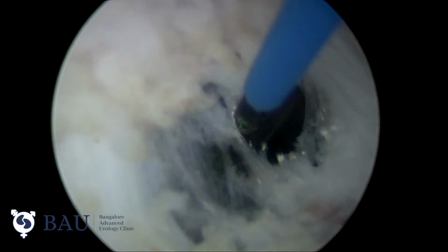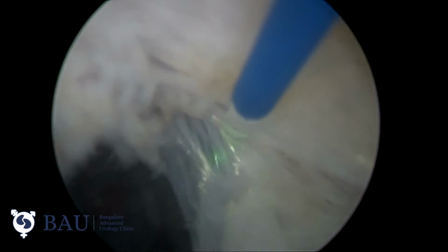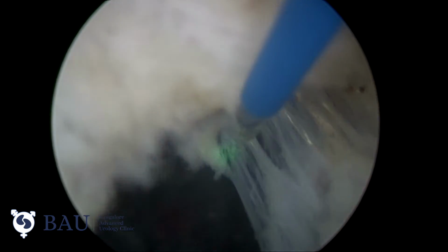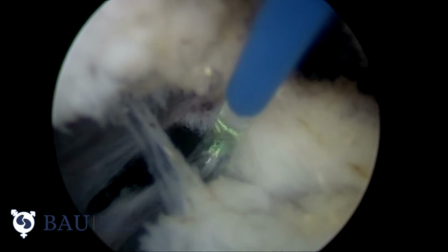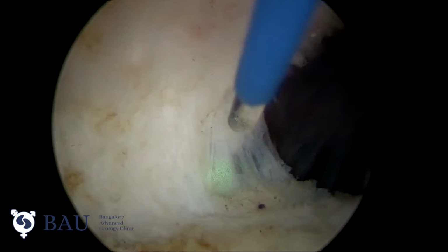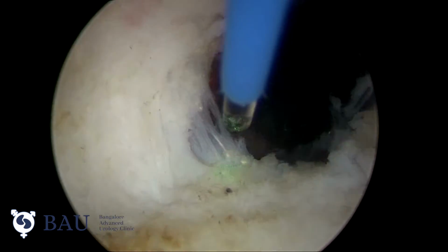So this is the bladder neck fibers. We have to make sure that there is no major bleeding from the mucosa here. That will disturb our morcellation. Once we identify the bladder neck, then we can proceed with the dissection.